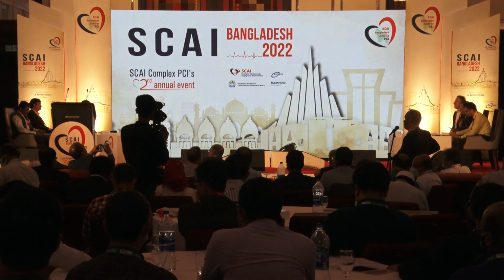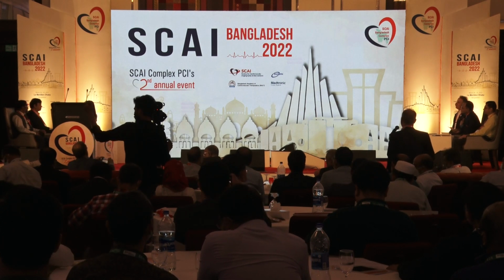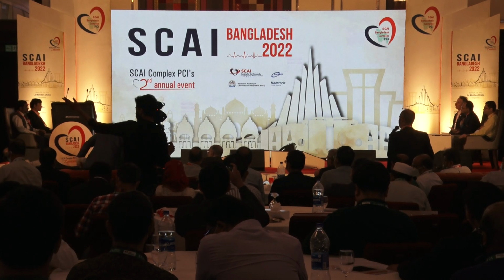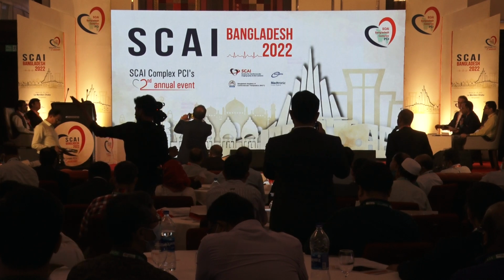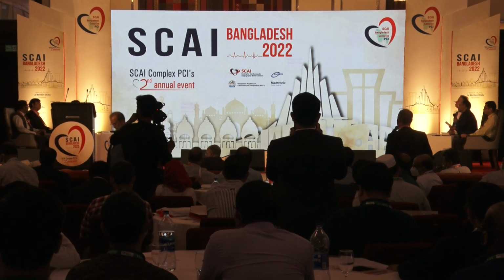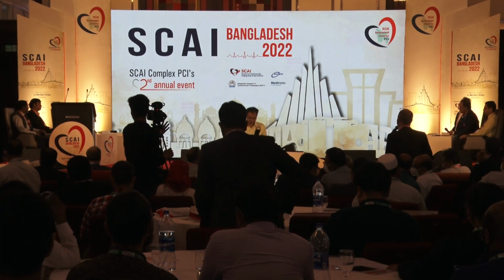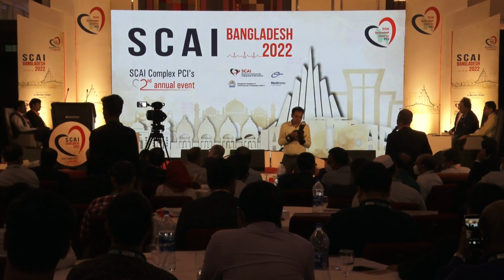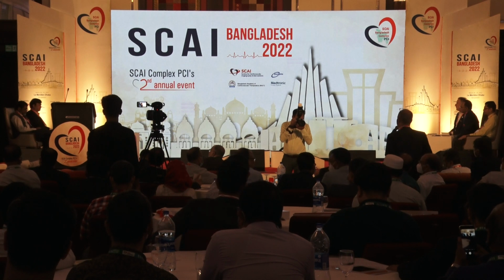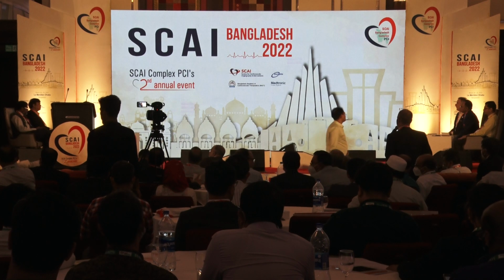I personally am more of a provisional strategist unless there is significant disease in the ostial circumflex extending longer, as Sanjog mentioned, longer than 10 millimeters. I'll usually go provisional. The only thing I mentioned earlier that I would differ on is that I started to do a pre-kiss with a balloon half the size smaller in the side branch before putting the stent in the main vessel, just to be able to re-access the circumflex more easily in a provisional strategy.